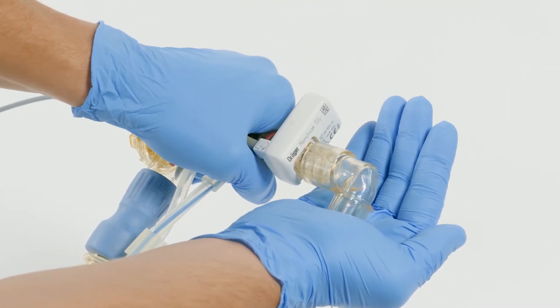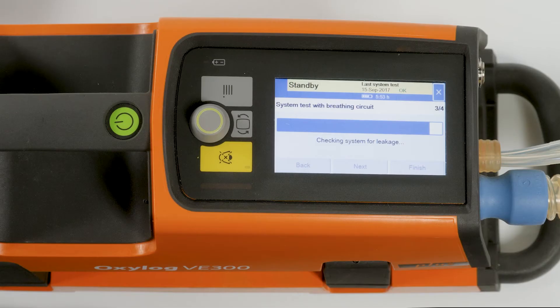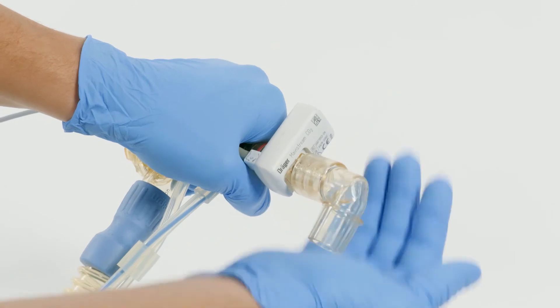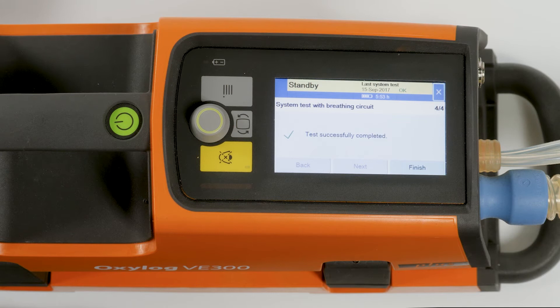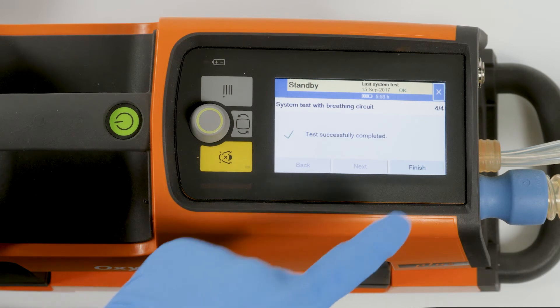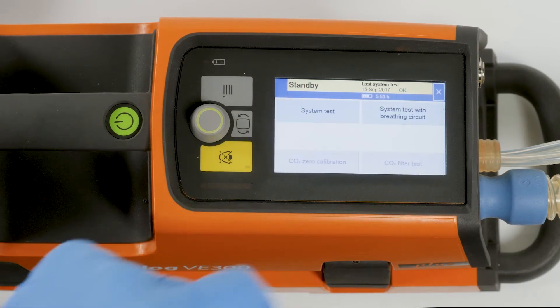When prompted, seal the patient port. When prompted, open the patient port. The test result is displayed on screen four out of four. To exit, touch the finish button.